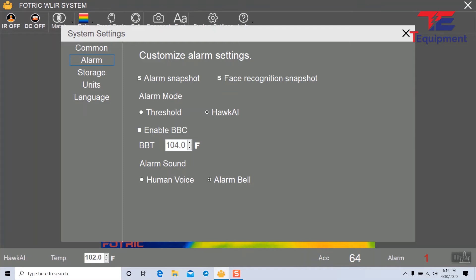The last part is the alarm sound. There are two options: the human voice you heard earlier and an alarm bell.